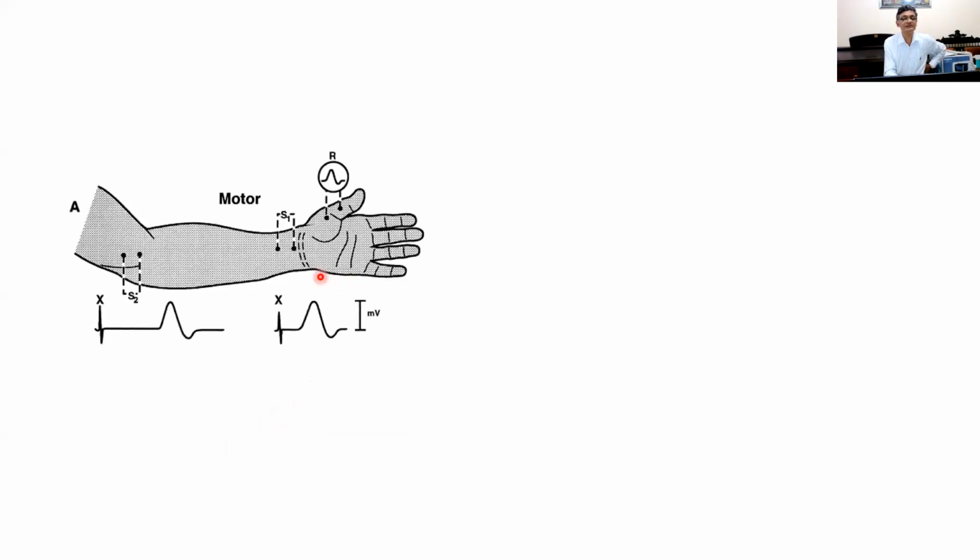This will give a little more detail. This is the recording electrode. This is the stimulating electrode, site 1, at the wrist joint. This is the elbow side, where the median nerve is stimulated at the elbow. When you stimulate at S1, the wrist, you see the initial artifact, a small disturbance, and then a little gap and the compound action potential starts. Look at the shape of the compound action potential; it's different from the spike potential. A spike potential is very sharp and comes down.